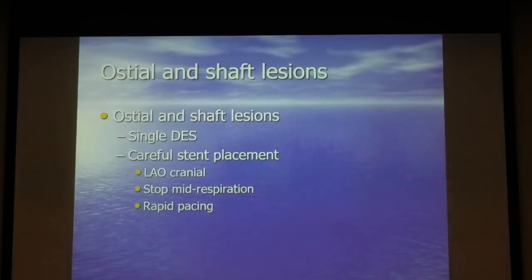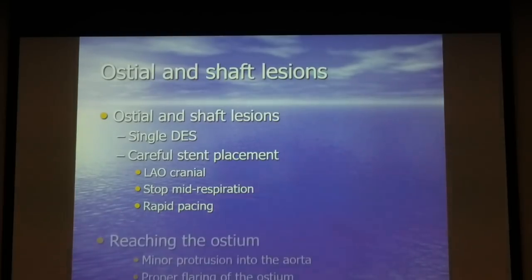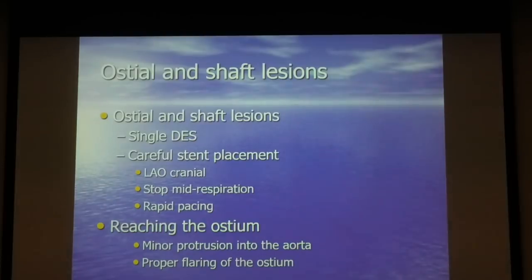You synchronize your thinking and your motion with the cardiac cycle. It needs some training, but it is sometimes helpful. When you think you are in the proper cycle, you just push the inflator all the way and it will stick. It's helpful, but I think these are the issues that you can use at the beginning. Stop mid-respiration, rapid pacing, intracoronary adenosine, and that will be helpful.